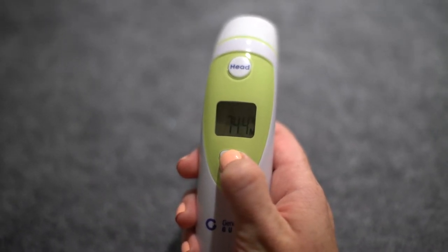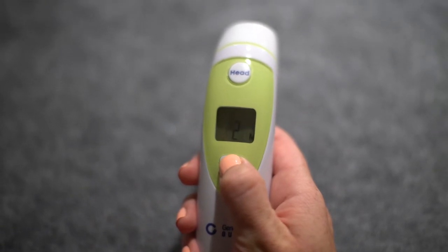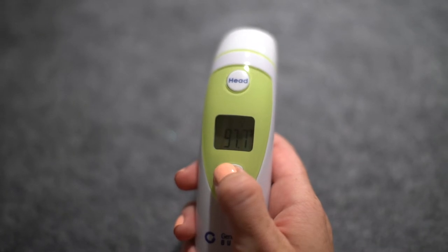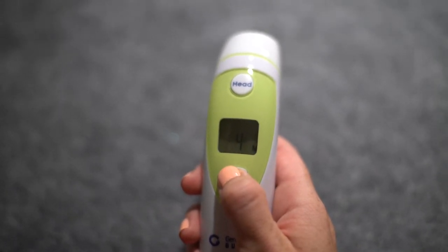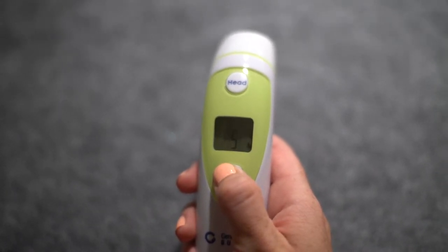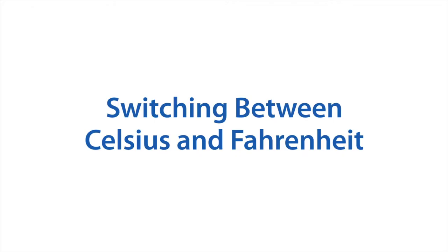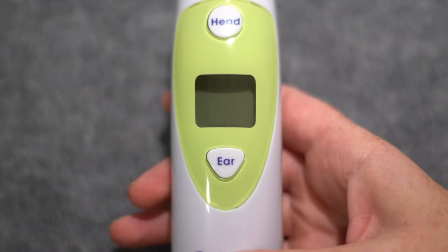Memory recall function: press and hold the ear button for four seconds to enter recall mode, where the screen displays dashes and a flashing M. Click ear again and the screen displays the data group. One to twenty groups can be stored, and you may scroll down by pressing the ear button.